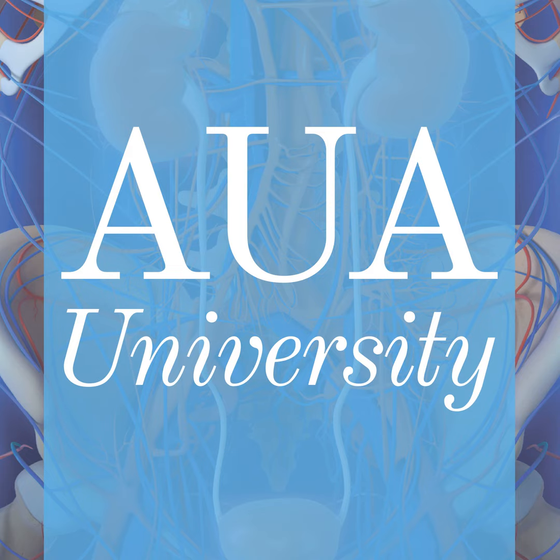In this situation, the PSMA PET scan was negative, and the doubling time was moderate. So I usually get the next PSMA PET scan if the PSA rises above 2, because then we know these primarily negative patients usually will switch to positive patients. If, however, there is still a negative PSMA PET scan with a PSA of 2, I would go back to the histology.